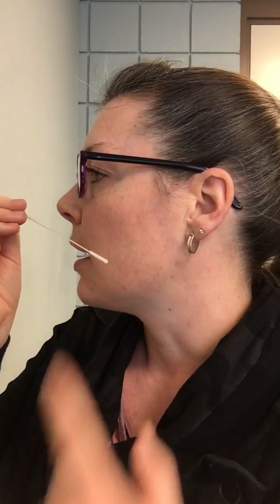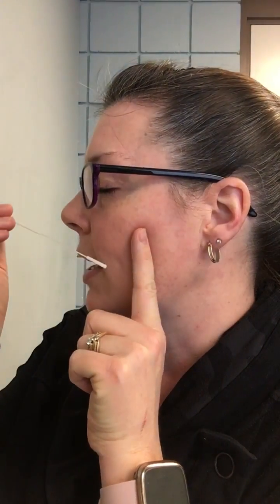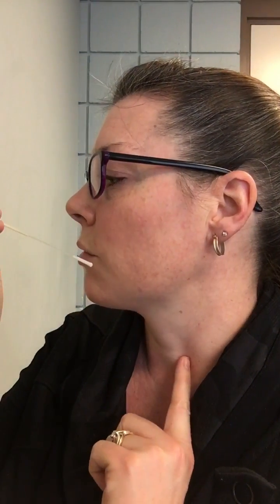When you're swabbing, you just want to make sure you're going at a downward angle. You're going to angle downwards towards the earlobe, and you're going to want to go about two-thirds of the way in so that you know you're right at the throat.